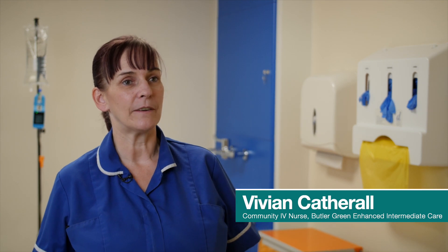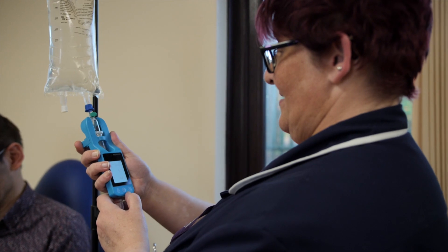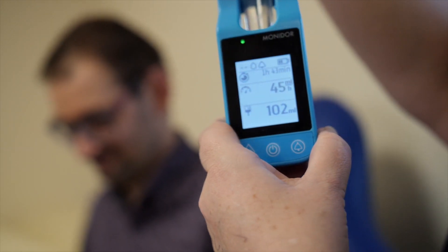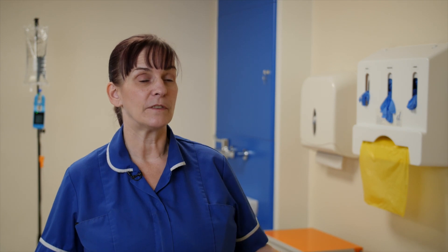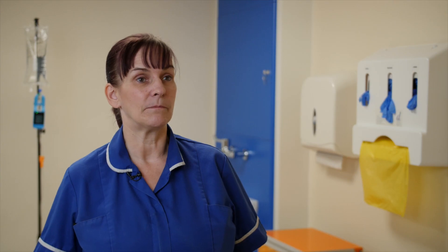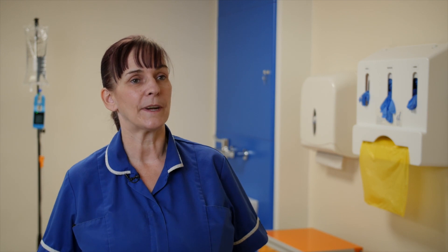I'm Vivian Catherall, I'm one of the community IV nurses for the Oldham area. We're based at Butler's Green which is the intermediate care centre, and its prime idea is to keep patients out of hospital. Our service picks up patients who would normally sit in a hospital bed having antibiotics and treats them in their own home, along with other services that also go in to prevent patients coming into hospital. As long as they're stable, we treat them until they are well enough to stop the treatment or to go on to oral antibiotics.